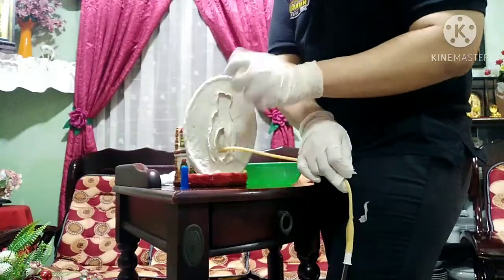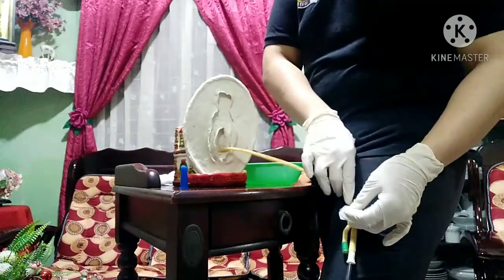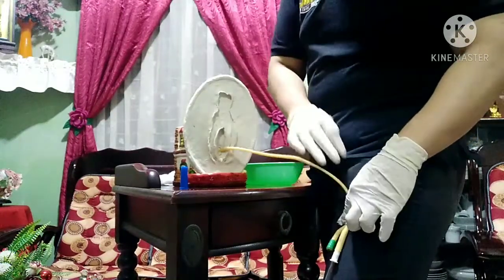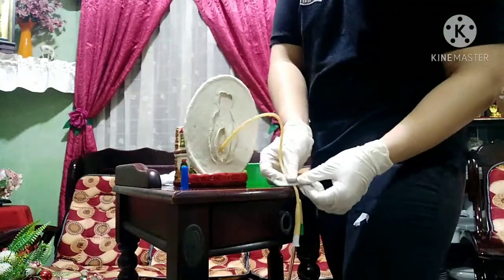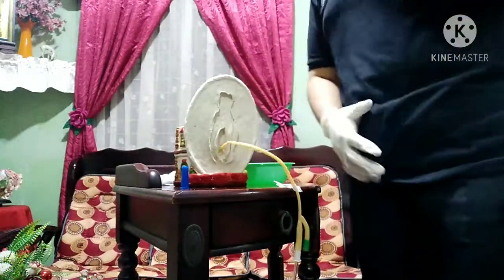Sorry po. Kunyari po, ito na lang po pala. Ayan, nakatape na po sa kanyang thigh. So, ayan.